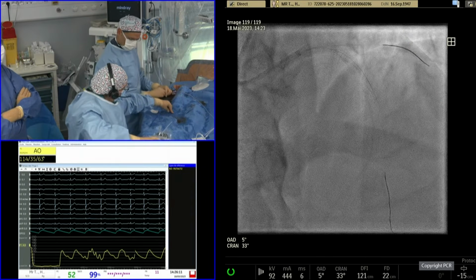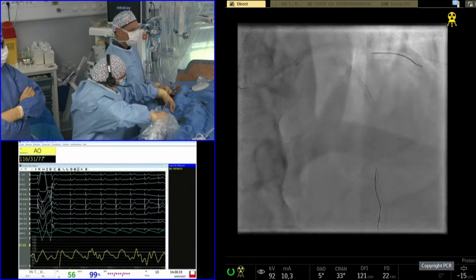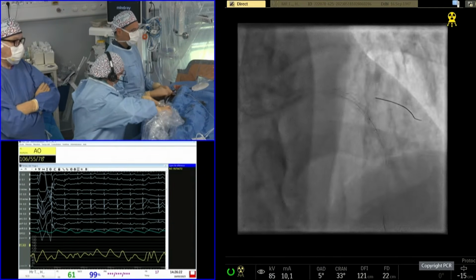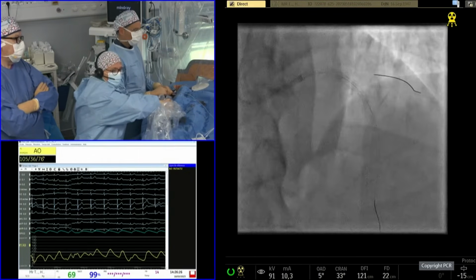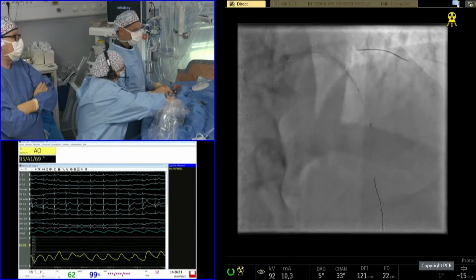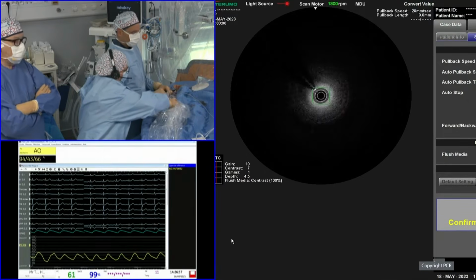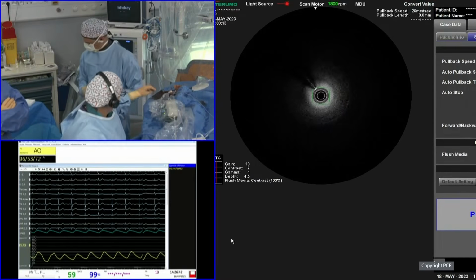But I'd echo Maciek's comments about using it systematically and using the acquisition as your angiogram, which means the contrast load actually becomes a non-debate. Obviously, we're waiting for data from the OCTOBER trial, excitingly, that will be reported at ESC in terms of whether using a systematic OCT-OFDI approach to guide wire crossing and subsequent optimization is necessary. But clearly, that's the experience of our Japanese colleagues.